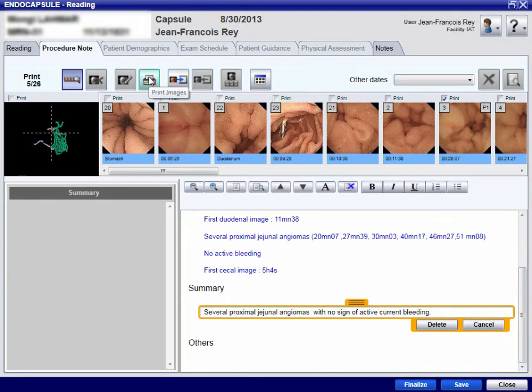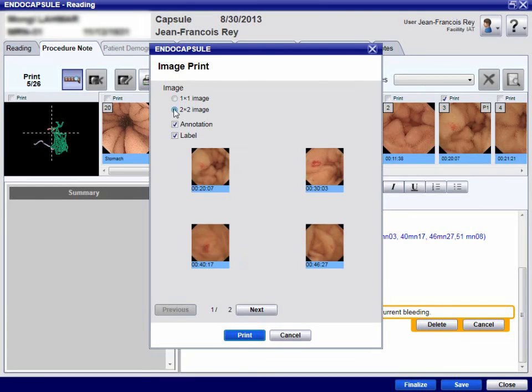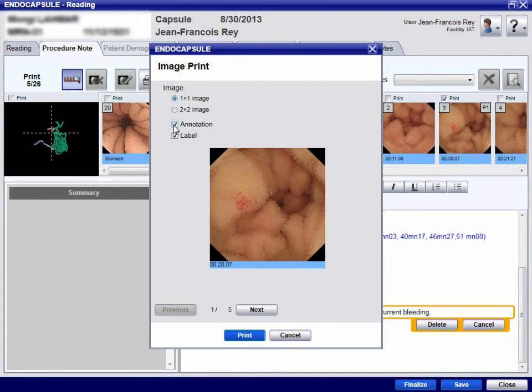Accurate reporting is mandatory. We use the WEO standard terminology for description of findings. The approximate location of abnormalities is shown in the 3D tracking graph, which is important for determining whether to use the oral or anal route for future planned balloon enteroscopy.